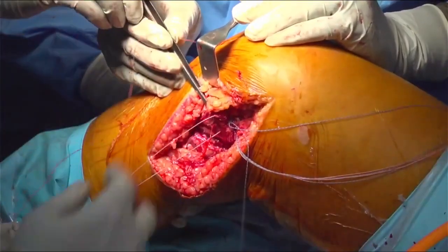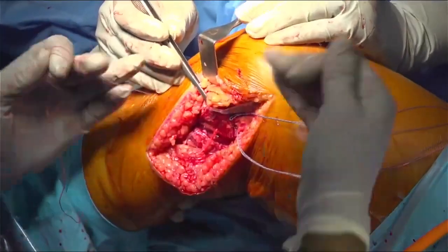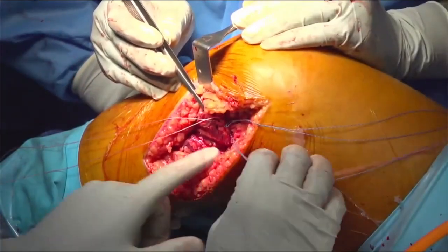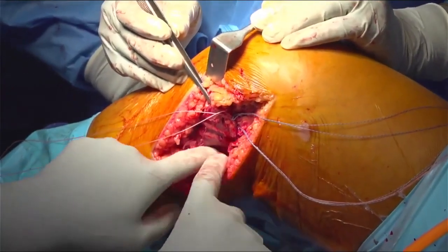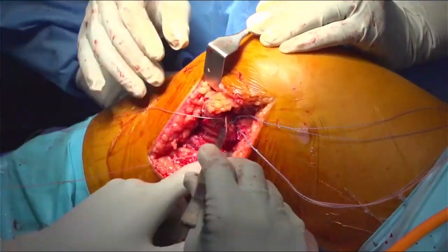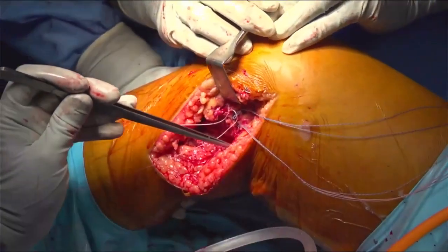So this is the first one and this is the second one. Okay? So by doing this, we are actually making them. LR anchor please. Okay, non-tooth forceps please. So now we know that this one posterior part is also there. So first pass ST please. So this one will be included in this part.